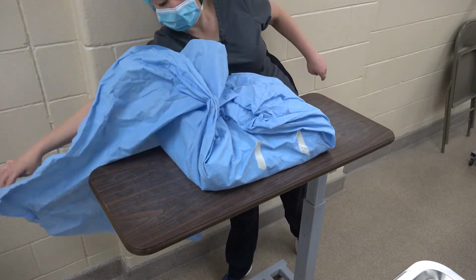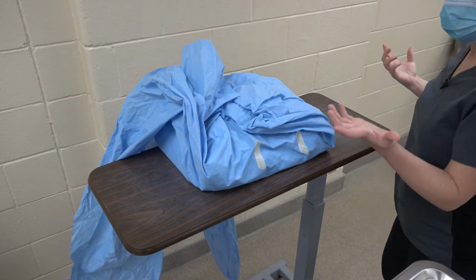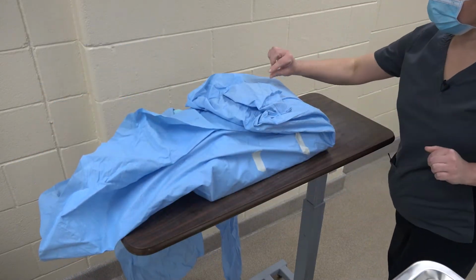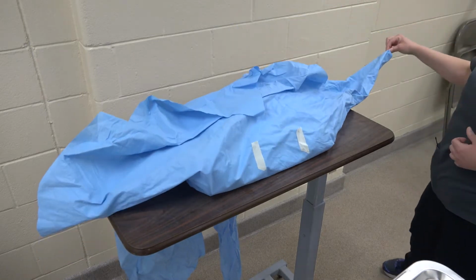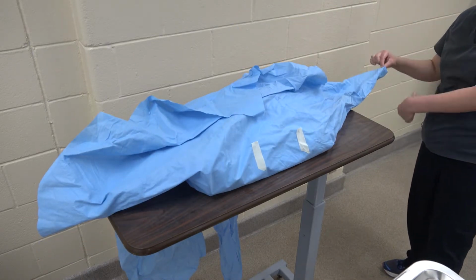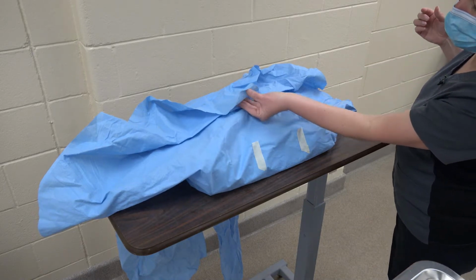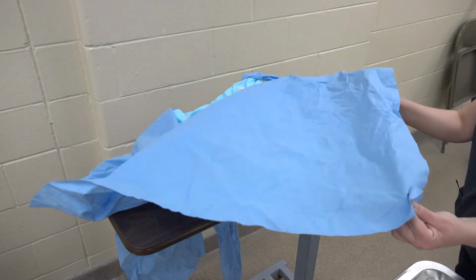So I'm going to come over that direction. It's a little bit cattywampus here, so I'm just going to fix that. Again, trying to grab the edges and the outside portion. If I don't grab, at least this is going to be underneath the table, and underneath the table is dirty anyway, okay? So see, I'm going to slip my hand under, try to grab the outside part of this drape.